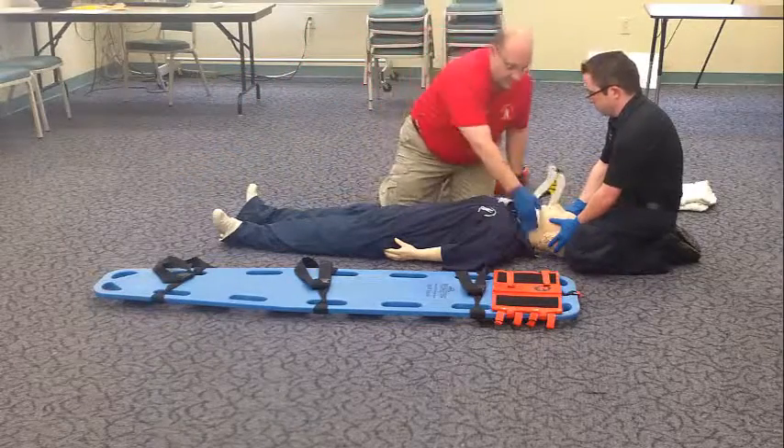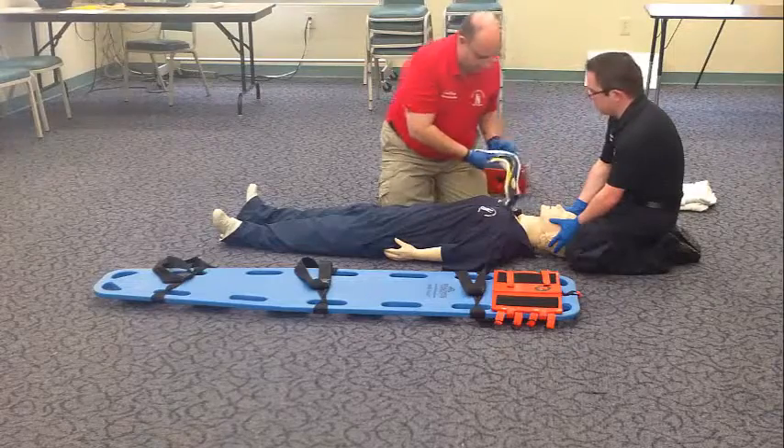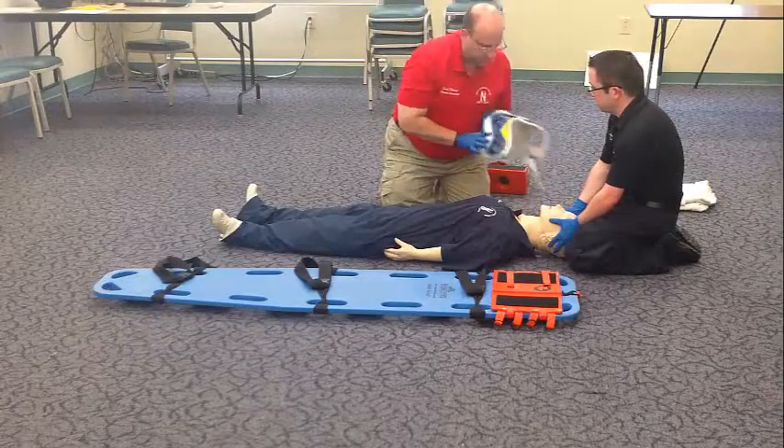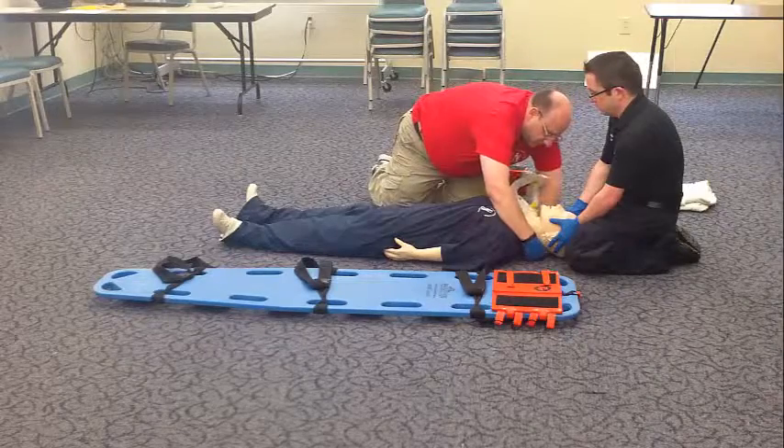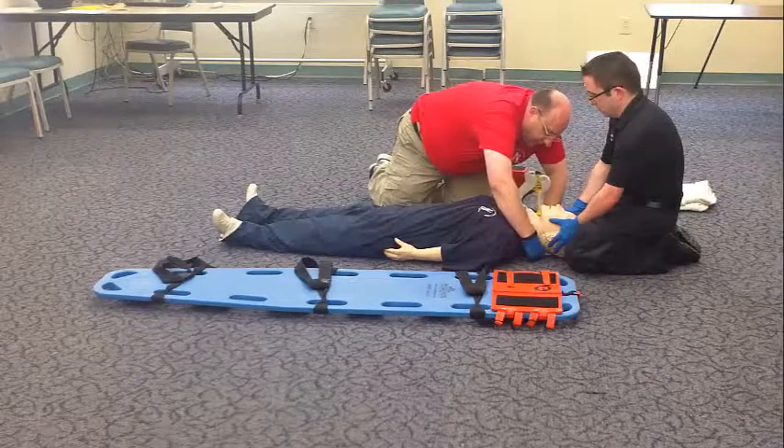I will properly size the cervical collar and apply it to the patient, directing my partner not to let go or move the head.